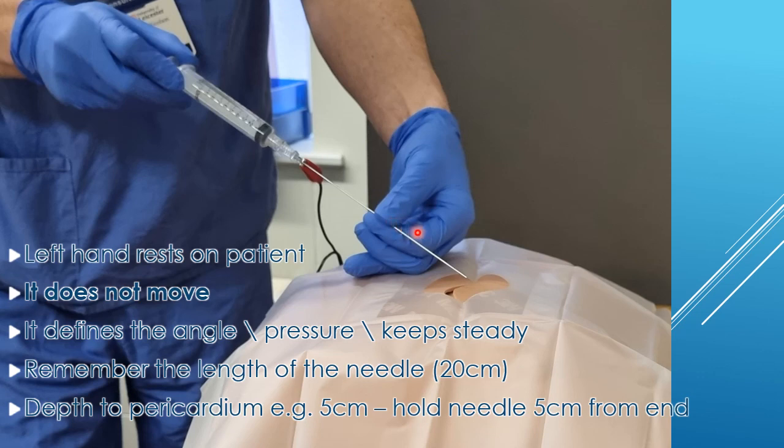Remember how long the needle is. One thing I like to do just before I actually insert the needle tip is to hold the needle at the point at which I want to insert it to. For example, to 5 centimeters, I'd hold it 5 centimeters from the tip. That then helps me to remember and to lock the distance that should be outside the patient when I've reached my desired depth. You do get some pericardiocentesis needles which have centimetre markings on them, and I do think that is a helpful measure when you have such a long needle. Do not move that hand from the start to the finish of the procedure.